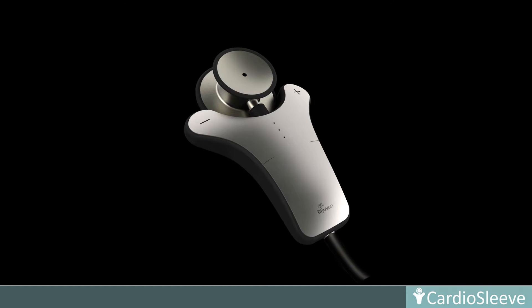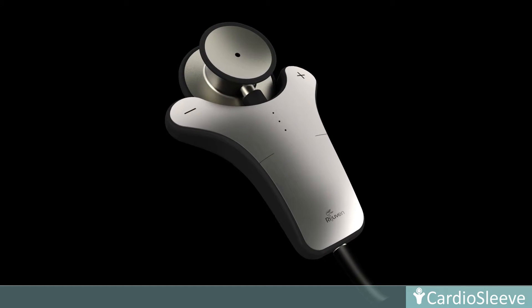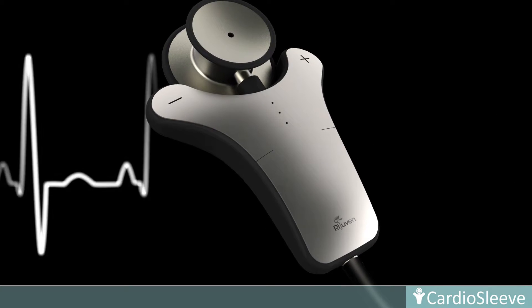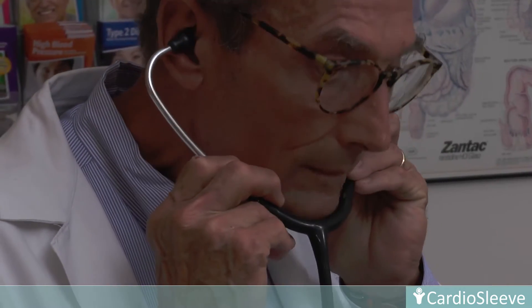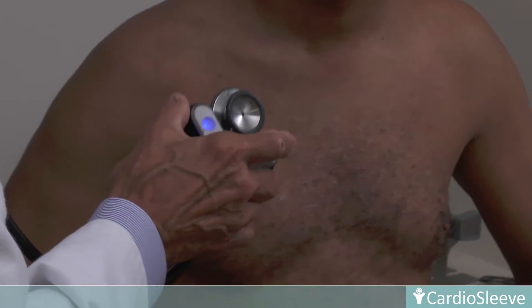CardioSleeve is the first FDA-cleared stethoscope add-on device that overcomes the shortcomings by acquiring both ECG and digital heart sound simultaneously. CardioSleeve not only transcends the limitation of human hearing, but also makes ECG accessible at any point of care.